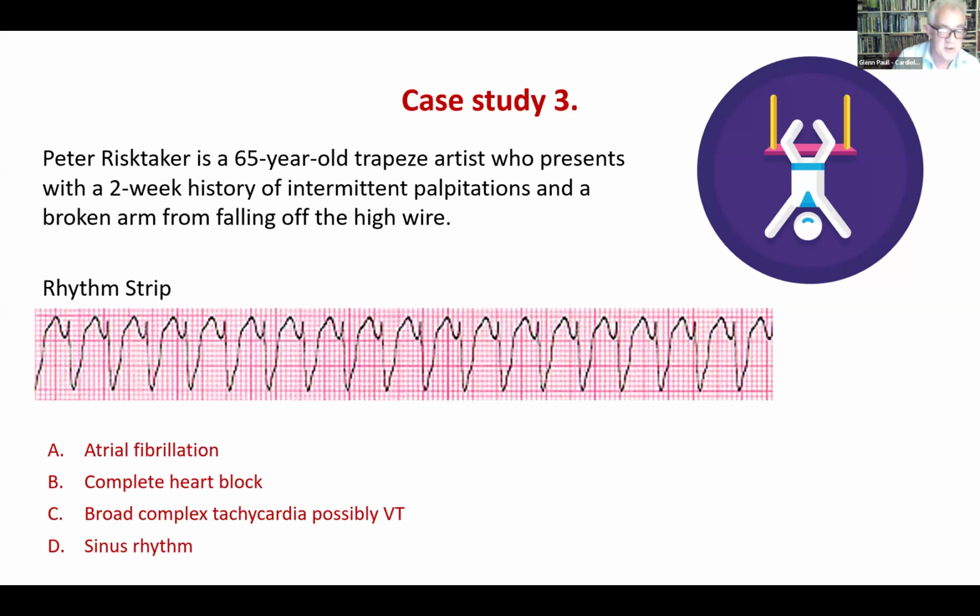The machines are meant to do a good ECG, and my argument would be that if you need to put a filter on, they should put the filter on all the time. But most of the ECGs about now are pretty good, and ideally they've already got acceptable filters on them. If there are additional filters and you need to use one, give that a crack, because otherwise if you're not happy with the trace, you're not happy with the trace. You can try that additional filter, and you just make sure you document that the filter was on. I don't think it'd make a great deal of difference. You'd still be able to see the rhythm, you'd still be able to see the ST segment elevation. It just might dampen things a little bit.